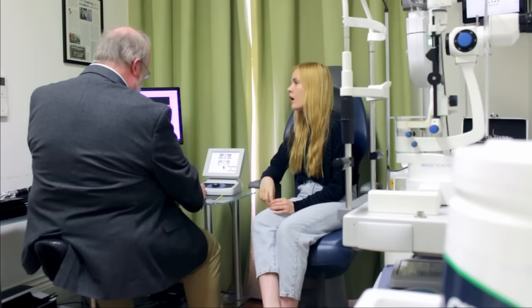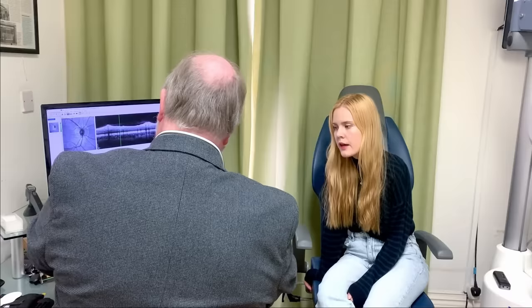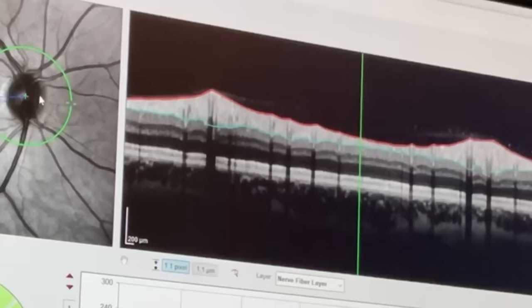But also, what this does, it takes a measurement of the thickness of it. It's a bit like a big ring donut, with a hole in the middle, and that's where all the blood vessels come out. And it's a bit hard to assess that. So what this machine does is it flattens it all out for us. So it takes that donut and flattens it for us, okay? And then we can look at the thicknesses in different areas. So as you can see, it goes a bit thick and thin in different places.